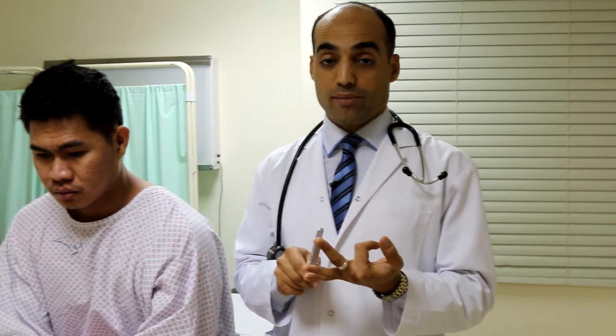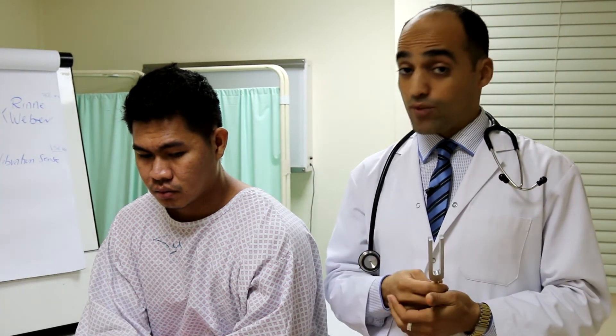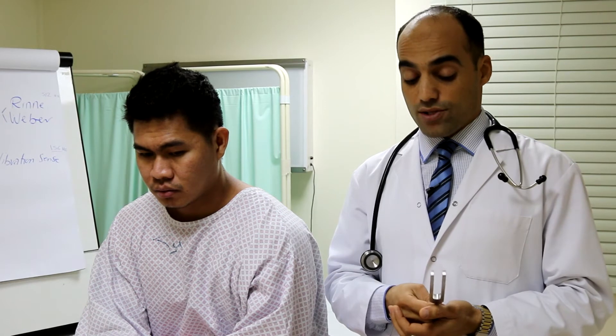In these cases, we need a detailed ear examination. In addition to inspection, palpation, and otoscopic examination, we should also perform the Rinne and Weber tests. Please read about conductive and sensorineural hearing loss to understand more about those tests.